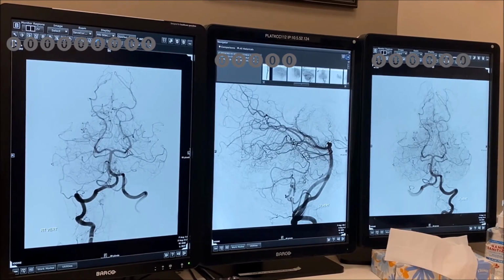Do selective. You do obliques. Okay. Today, obliques were you can do 3D and it's just going to be the same, prettier.